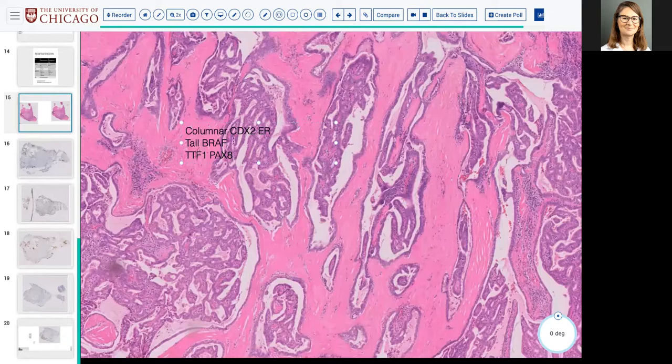Okay. What else? A metastasis from colon would have columnar morphology too, but she's young and probably doesn't have colon cancer. You said cribriform, so what do we think about with cribriform? Beta-catenin, morular. Yep, like Heather's saying. All right, great.